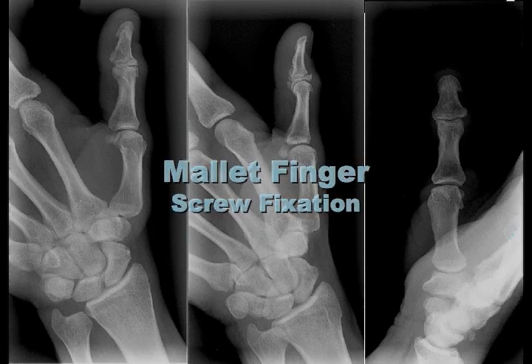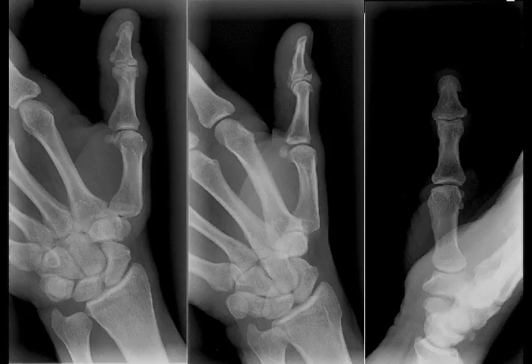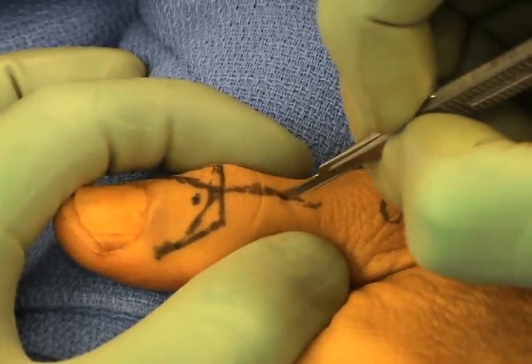Open reduction and internal fixation for the mallet thumb. In this patient with an avulsion of the base of the thumb distal phalanx, internal fixation is performed.